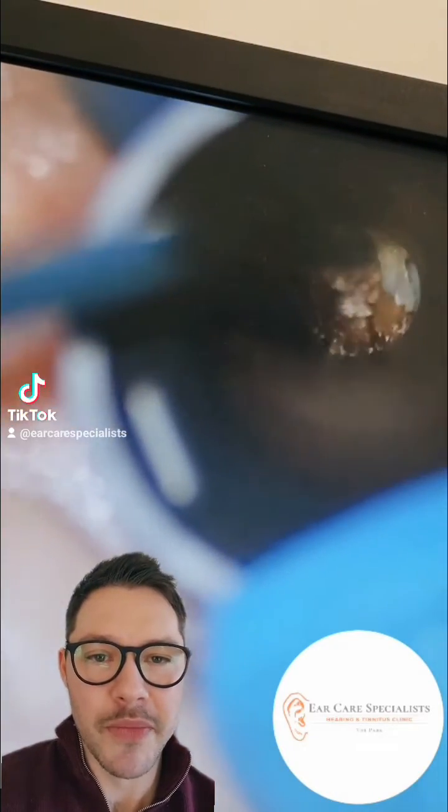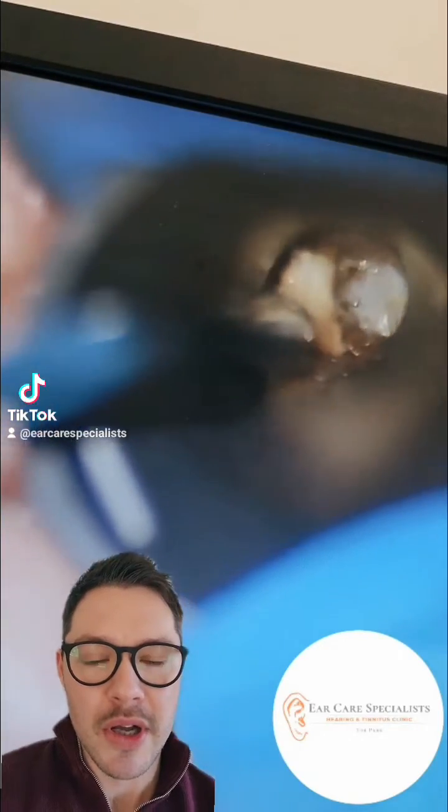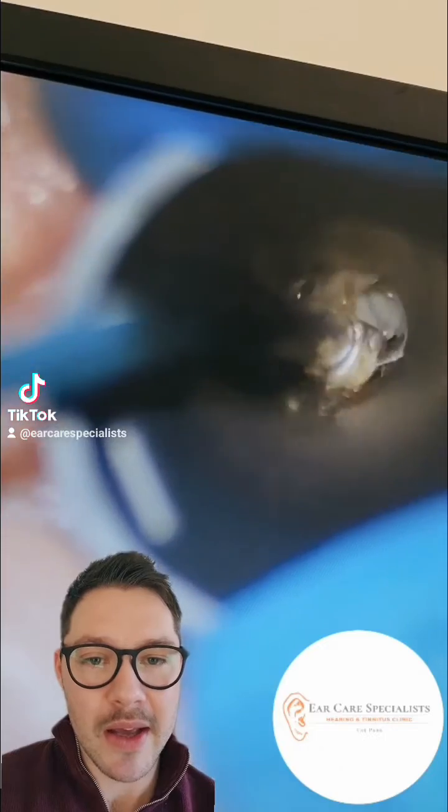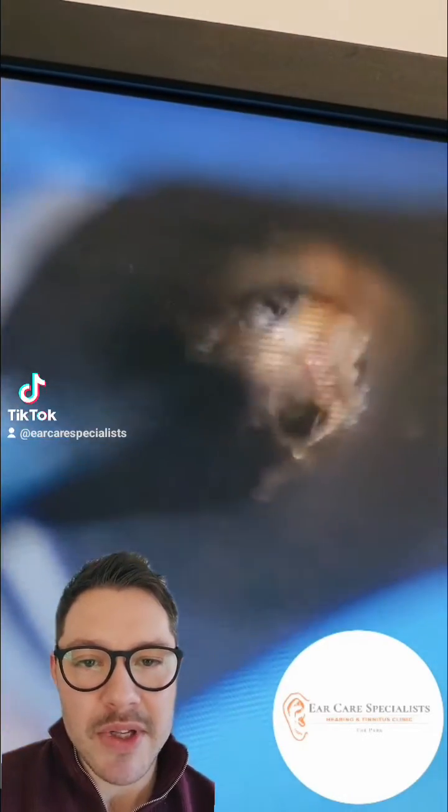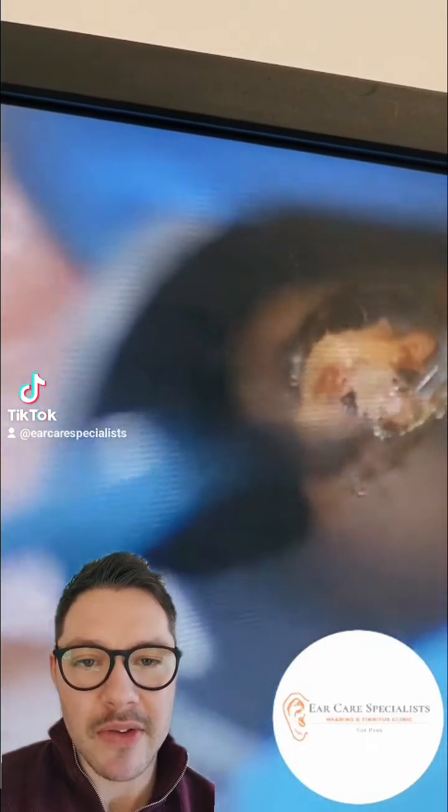So here we go. We'll just put a little speculum down into the patient's ear, which is a funnel. Sometimes it's required, and we're using the microsuction to effectively suck out the earwax from the ear. There's quite a bit of debris, skin debris, in this particular patient's ear as well that you can start to see.